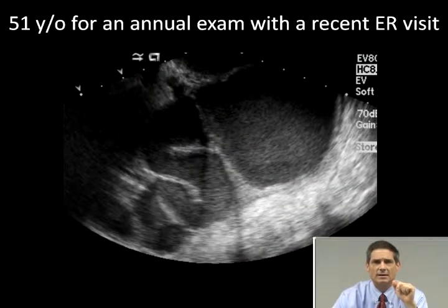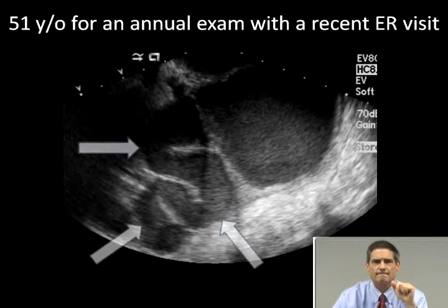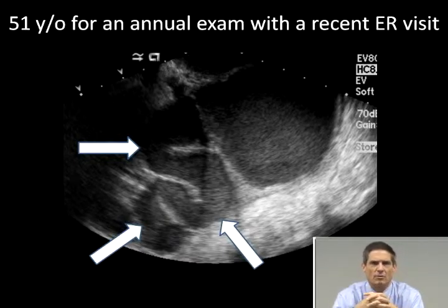So here's the ultrasound study, and you can see this big tadpole-looking thing here with arrows along where the tail of the tadpole is. Note the serpentine appearance of this hypoechoic region. It shows a gradual increase in caliber along with some internal echoes. This appearance is classic for hydrosalpinx, and the internal echoes suggest a superimposed infection or pyosalpinx, particularly considering the patient's clinical history, which included fever. So the diagnosis on the ultrasound was hydro versus pyosalpinx, and the patient was treated with antibiotics.